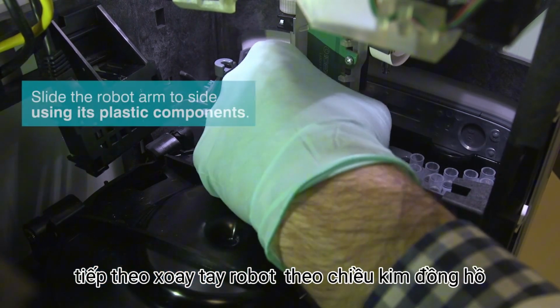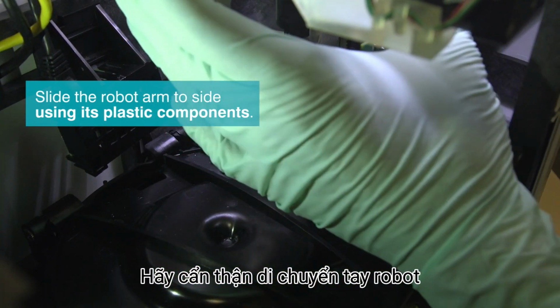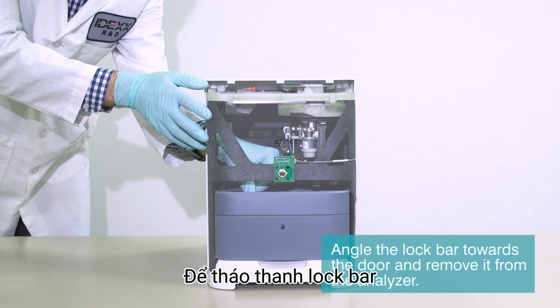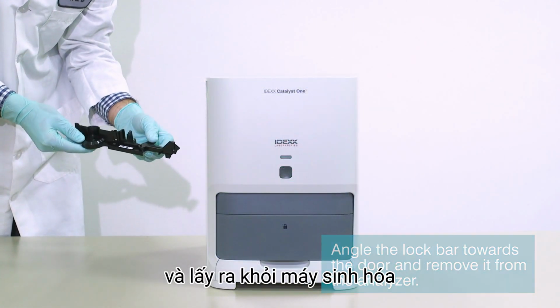Next, rotate the robot arm clockwise and slide it to the reagent side of the sample drawer. Be careful to only move the robot arm by its plastic components. Next, you'll need to remove the lock bar so that you can inspect it for damage. To remove the lock bar, lift up the pipette tip side of the lock bar, angle it toward the side door, and remove it from the analyzer.